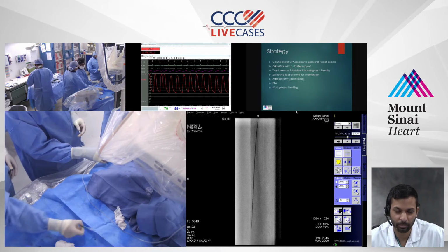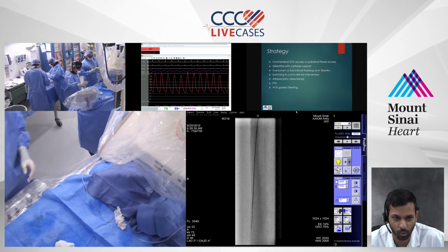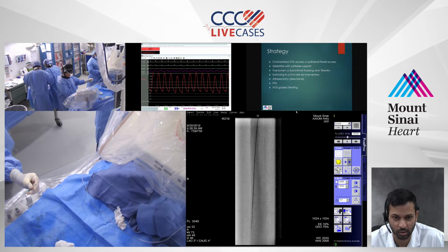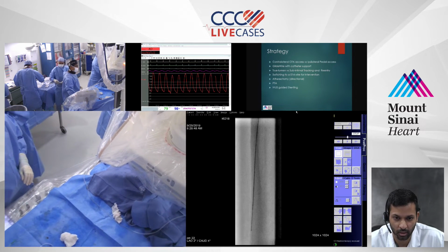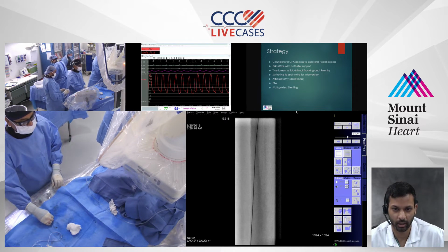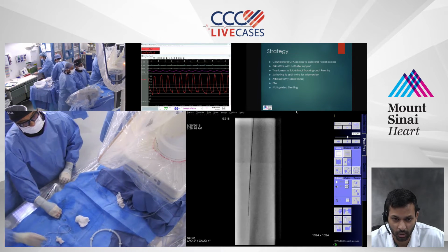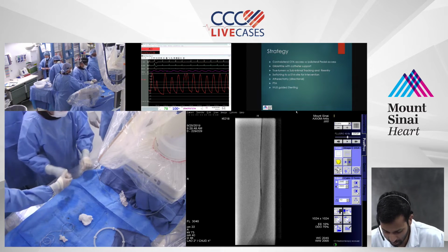Yeah, that's a great point. I think you alluded to it. You can make a patient have worse outcomes or make them a worse bypass candidate with the endovascular intervention if you're overly aggressive with the target vessel. Like you said, you don't balloon distally so the patient still has a good bypass option, or stent the target location in the tibial. I think those probably in part contributed to why endovascular first wasn't a free gimme without any consequences. It's about how you manage the target, and if you still preserve it and there's no change, then I think it's still safe to do. So that probably in part explains why they saw that.